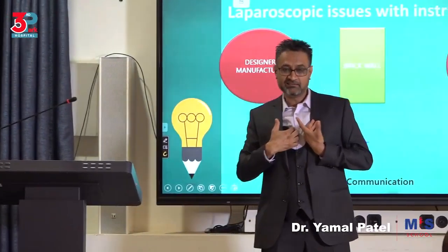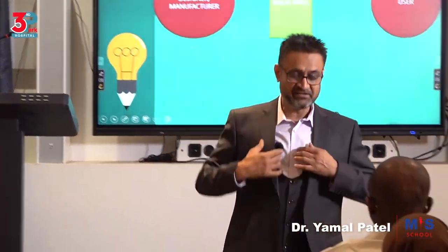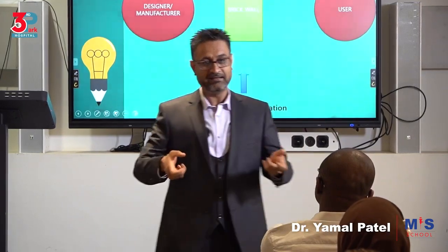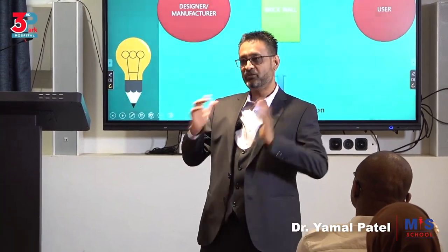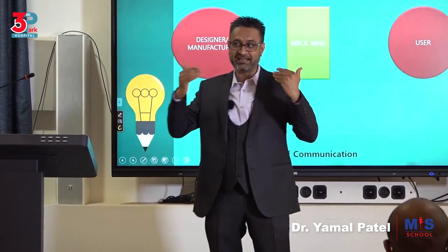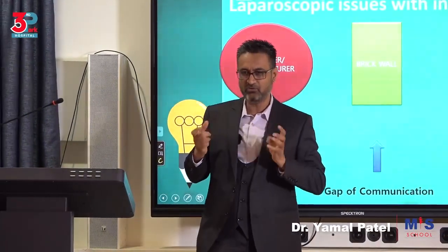I foresee a future where the manufacturers will probably come and say, sir, you know the way they make your suit for you? They'll say, sir, can I take the measurement of your hands? I want to make you customized instruments that will fit your hand. Wouldn't that be the best? So when you go into theater, you're told, okay, remove Yamal Patel's set of laparoscopy. But jokes aside, guys, ideally that should be happening. What I meant was, why not have customized sizes based on how your fingers and hand size are? You get what I'm saying?